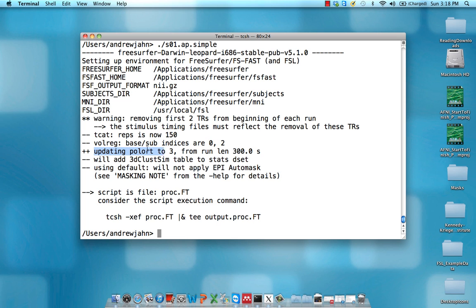Updating Polort to three from run length equals 300 seconds. Because each run is 300 seconds long. Just a brief review, there are 150 TRs and each one is two seconds, so there's 300 seconds total in each run.